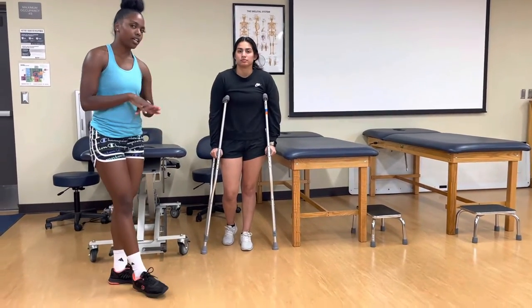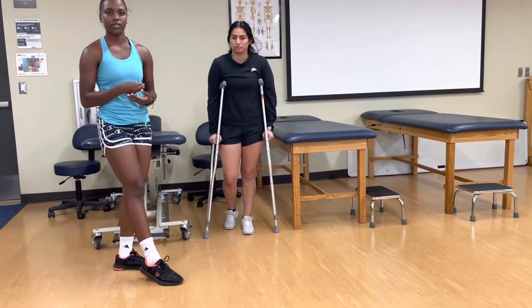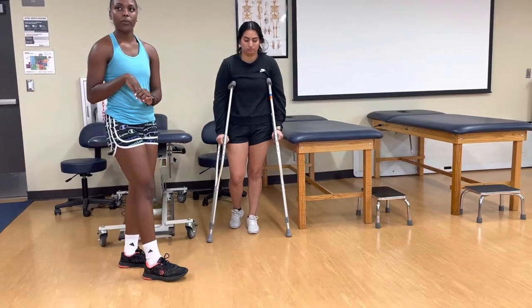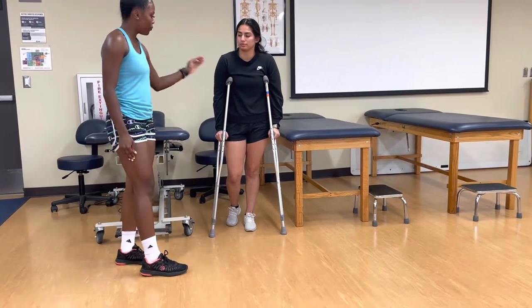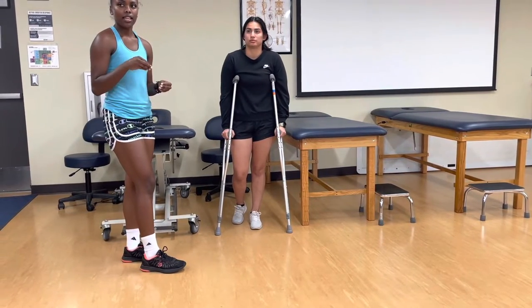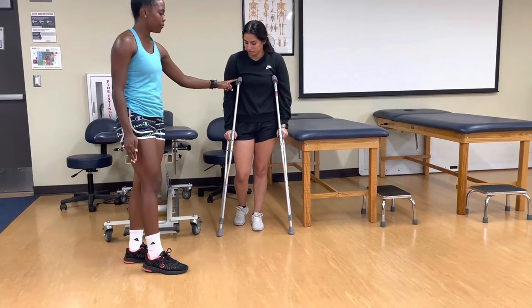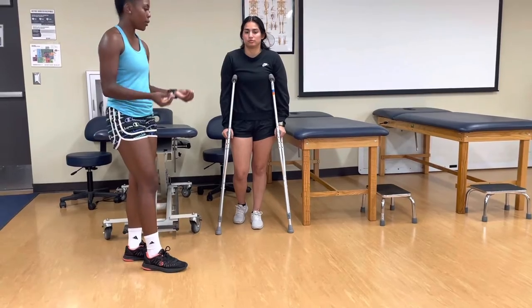You want to make sure that your patient is wearing proper footwear — something with a neutral heel that they're comfortable wearing. We want to make sure that the elbow flexion is 20 to 30 degrees. We also want to communicate that the top of the crutch should be pinned against the patient's rib cage when they walk.